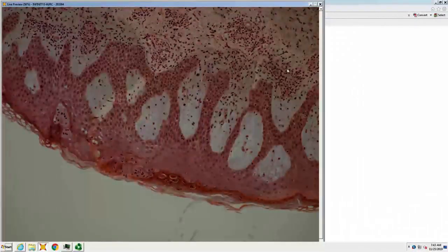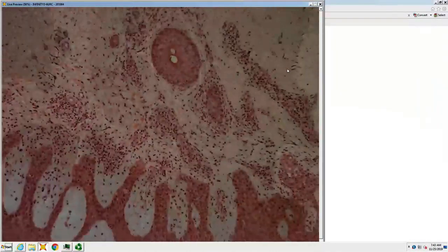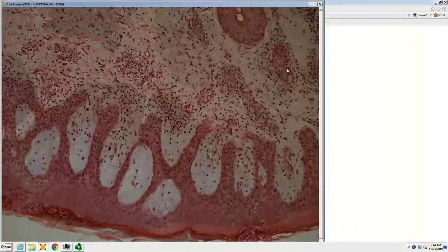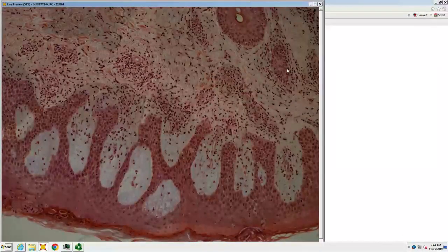EDV? So, would be a thought. I mean, you certainly have some spongiosis, you have some crust, some serum, dermal edema. The history is these are juicy red papules in a kid clustered at elbows, knees, dorsum of the hand, cheeks. Gianotti-Crosti. Very good. And it's the sort of thing where the histopath doesn't really help you until you pair it with the clinical, and then you've got your diagnosis.